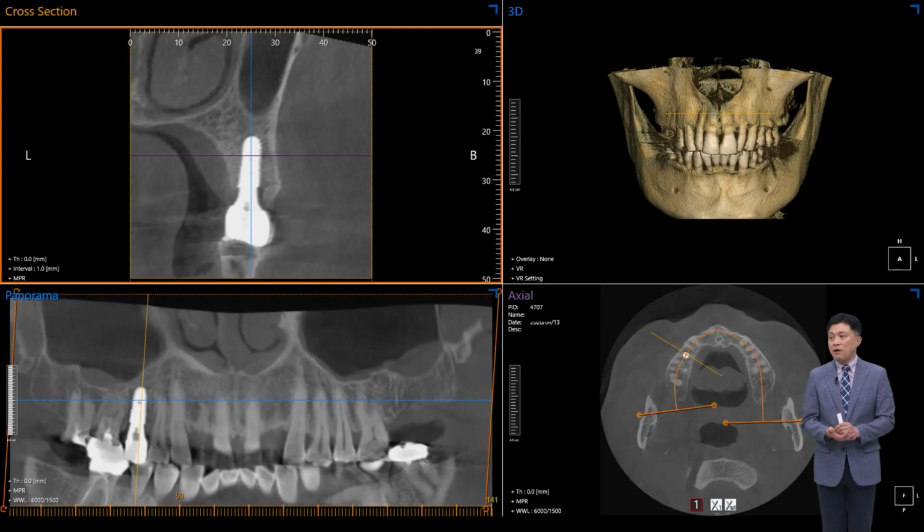As shown, in immediate implant placement, the position of the implant is very important. Yes, it is important for all kinds of implant placement, but especially in immediate implant placement, correct position of the implant is essential, especially because there are not that many references you can utilize. That is why I wanted to emphasize it.